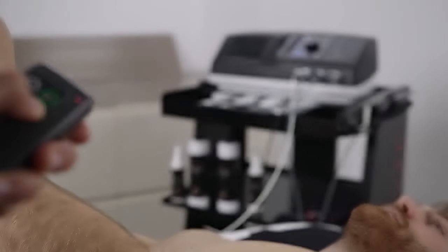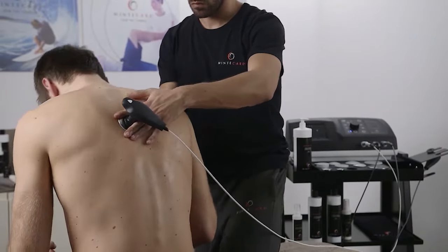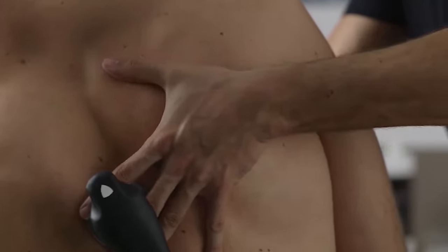T Plus remote control facilitates therapy and allows the therapist to always rely on the exact amount of energy, reducing error risks.